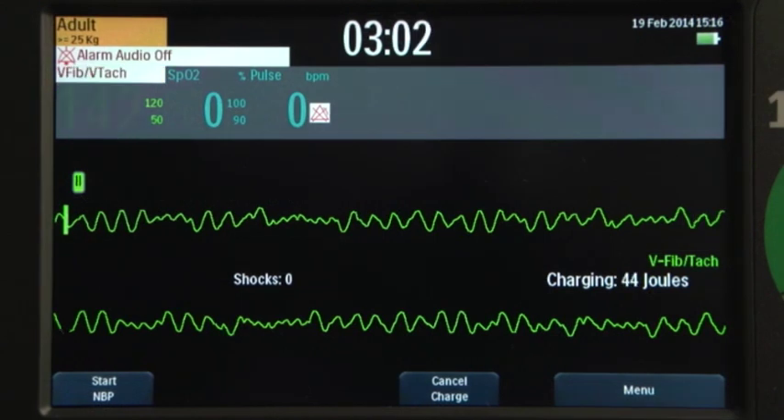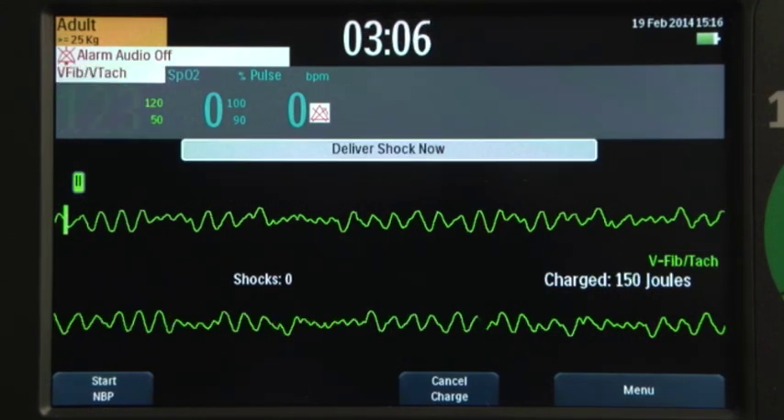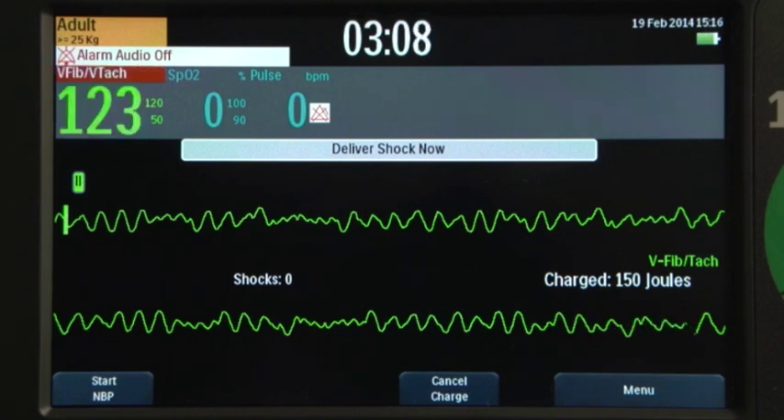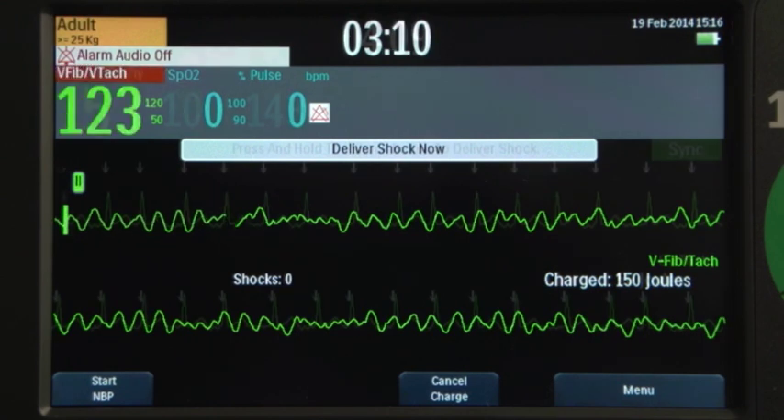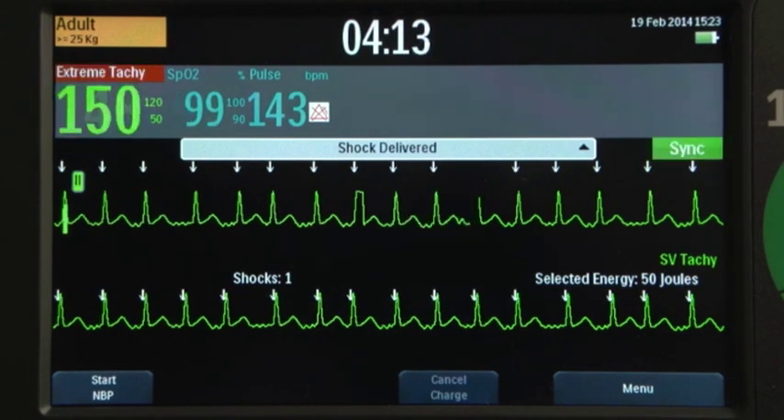Manual defib mode offers simple 1-2-3 defibrillation using multifunction electrode pads or external or internal paddles. Manual mode also allows you to perform synchronized cardioversion.